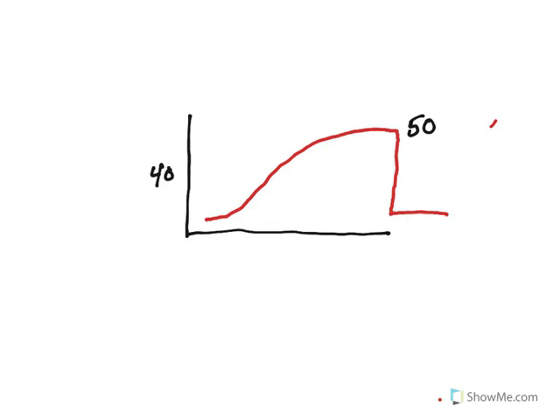But you notice the waveform here, and the problem with this waveform is that the upslope sort of melds in there. We don't really get a good plateau. There's no real good plateau in here. All of this area is still on the upslope, and that tells us that the patient is constantly pushing against something, and in this case, they're pushing against bronchospasm.